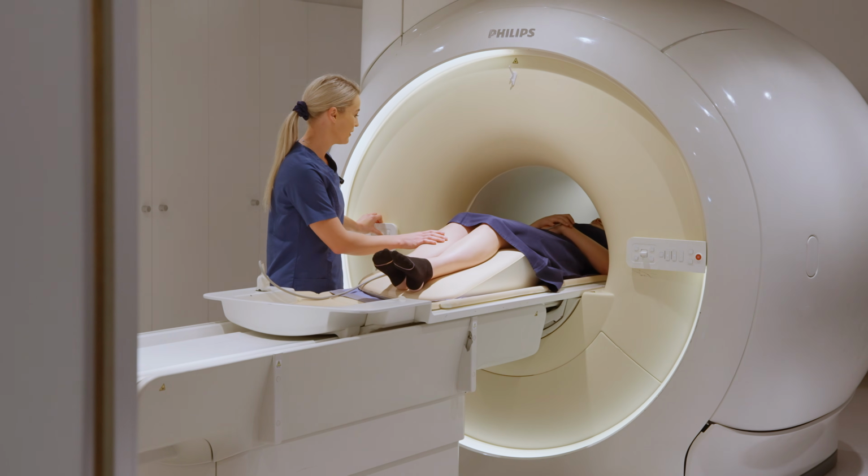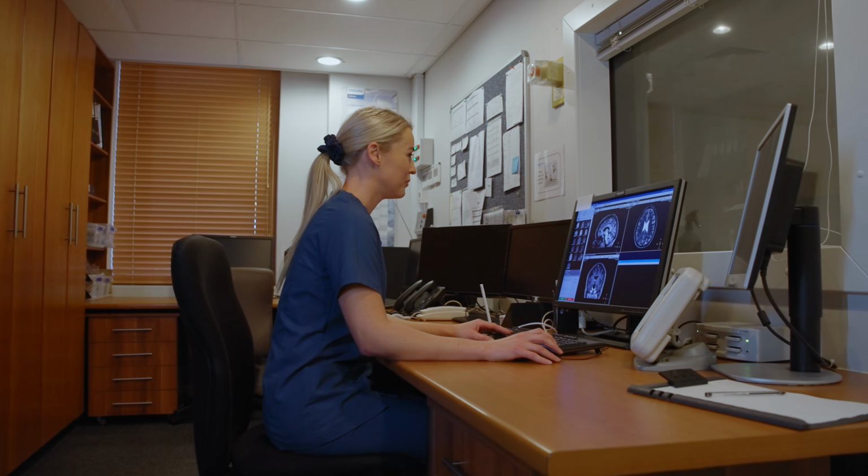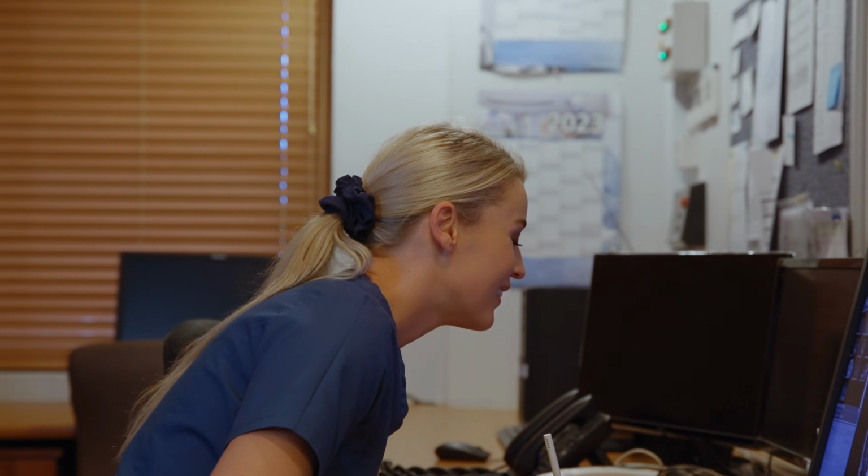Once you are positioned, the radiographer will push you into the tunnel, step outside and conduct the rest of the scan from the outside. It is important to note that we will communicate with you from the outside via the earphones.